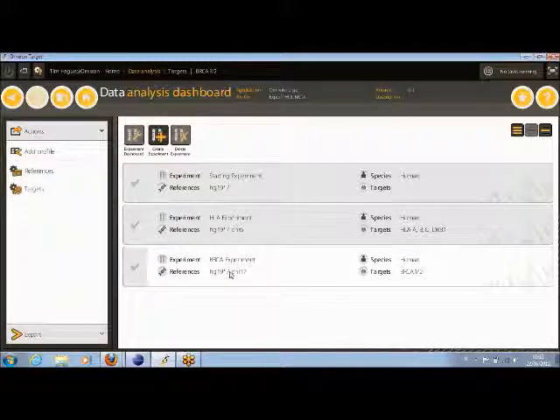So adding a profile will also create you a first experiment for the profile and the first analysis. I think this is a good time just to quickly take a step back and talk a bit about the data management side within the tool. We have a small hierarchy for data management.